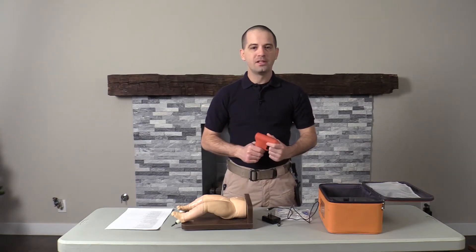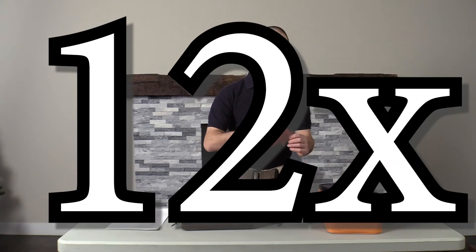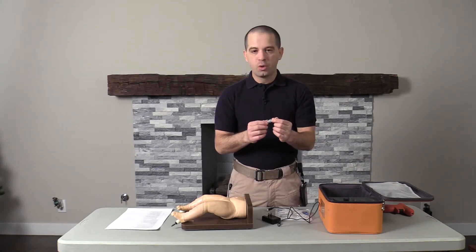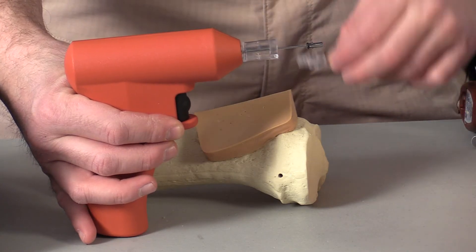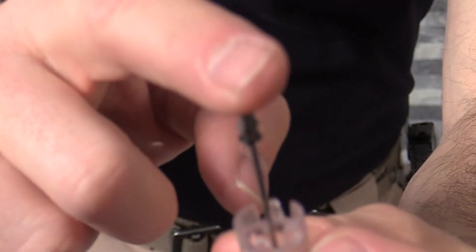Fourth, the battery life is amazing. According to BD, their battery lasts 12 times longer than the Teleflex EZ I.O. gun. And fifth are the needles. The needles are actually pretty cool because they have a passive safety device. As you open the needle up, you actually have a tip that prevents you from an accidental needle stick.